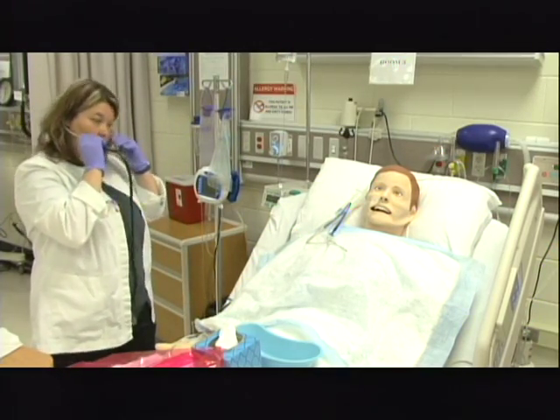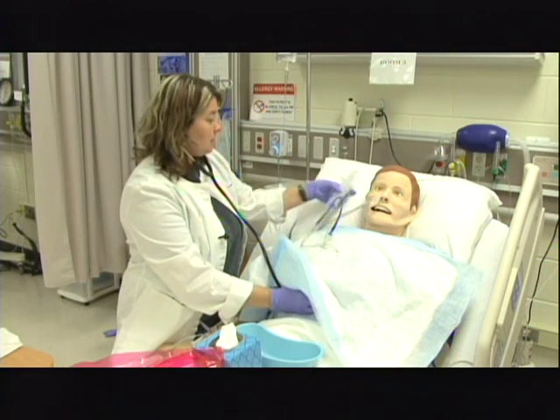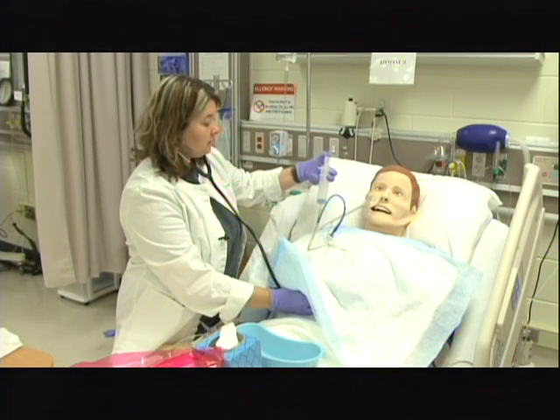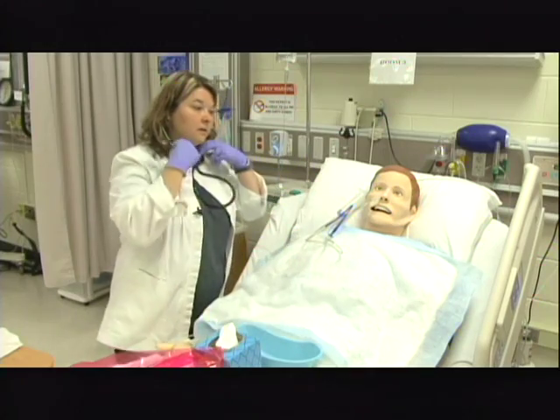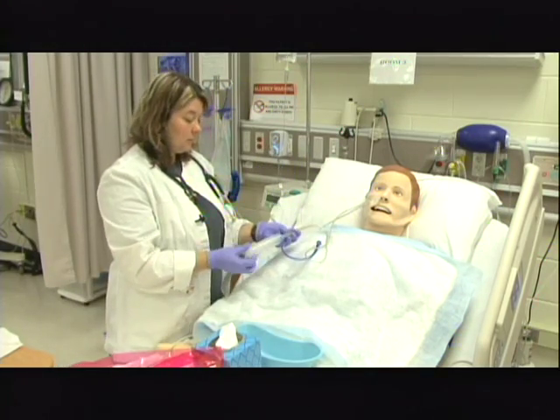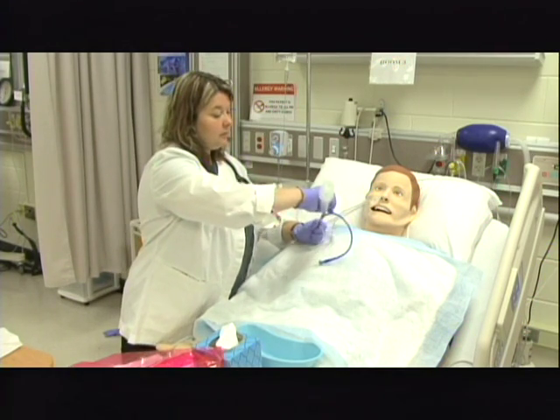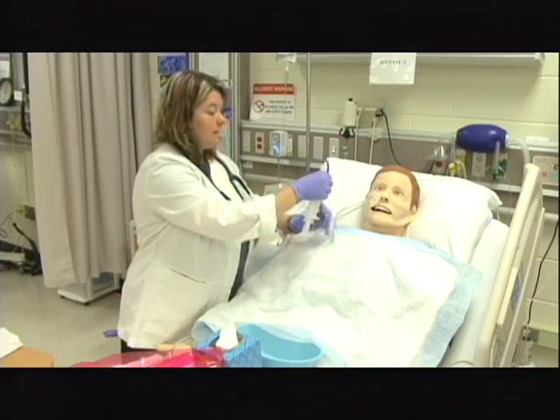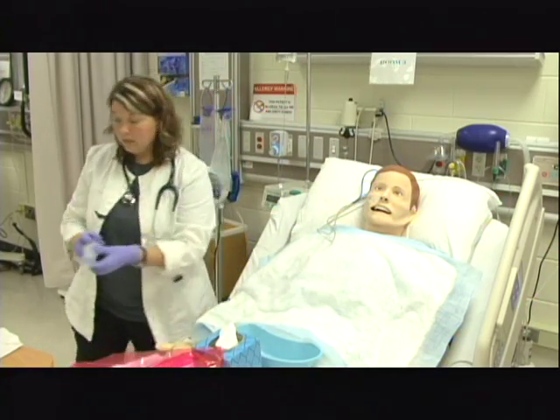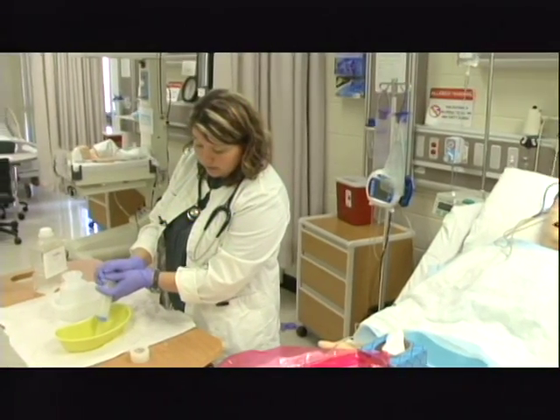Put on my stethoscope. Come back down to the patient's epigastric area. Again, inject the air, listening for the whoosh. Now that I've heard that, I'm going to come back up here and I can pull back or aspirate and get some gastric contents. I can then clamp the tubing and put the anti-reflux valve back in and above the patient's stomach. Come over here and put the actual aspirate on the pH paper.